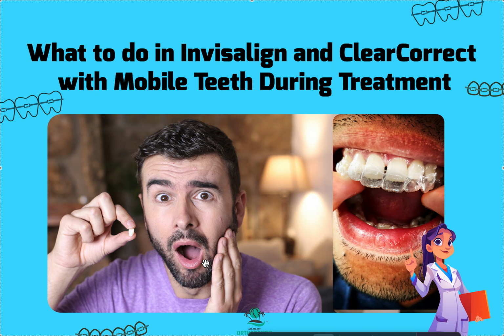On perio patients, I might slow down the Invisalign by 3 and slow down the ClearCorrect by 4. So far with Invisalign and ClearCorrect, I've had no issues slowing things down. They don't give me any attitude. SureSmile does give attitude. They actually say no. So, these are things to take into account.